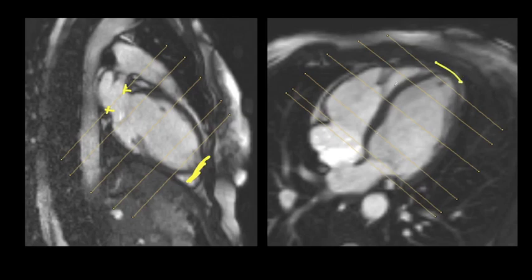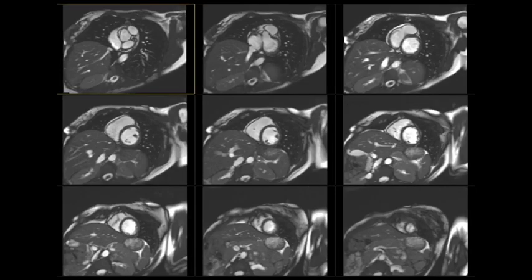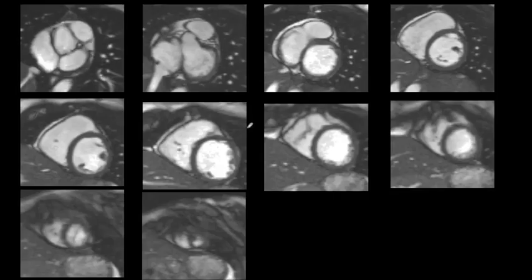You go perpendicular to the septum, you go parallel to the AV groove, and your slice thickness is usually 8 mm with a 2 mm gap, or you can do it with 7 mm and 3 mm gap. And this gives you your short axis cine.